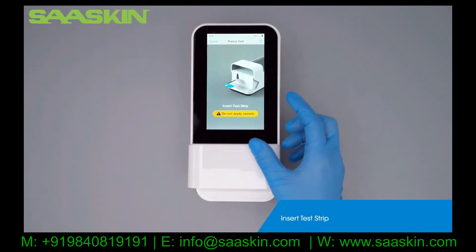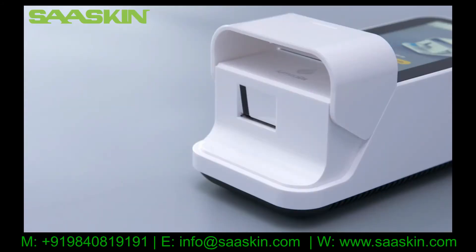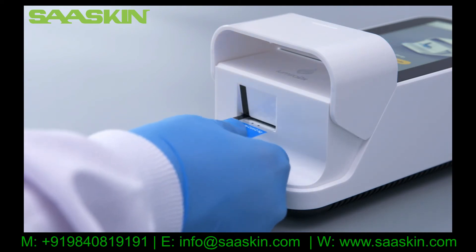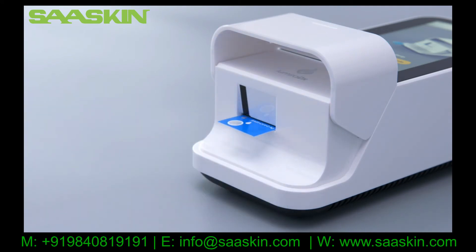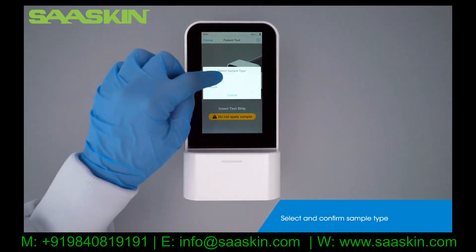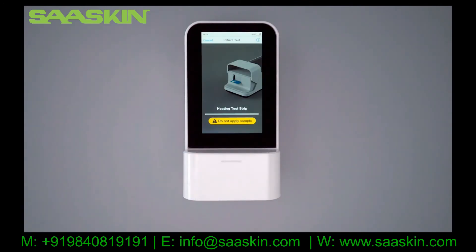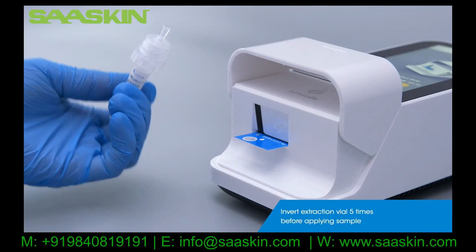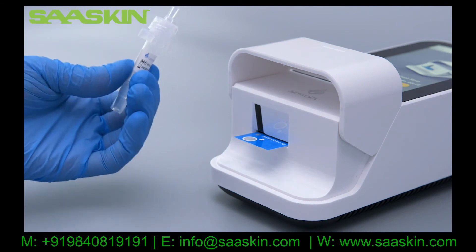When prompted, open the door and insert the test strip. Select the sample type you wish to test. Once the test strip has been heated, the instrument will prompt you to apply the sample. Gently invert the extraction vial five times before applying one drop of the sample to the test strip.